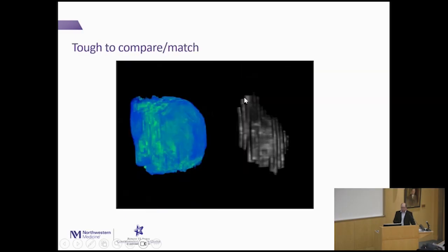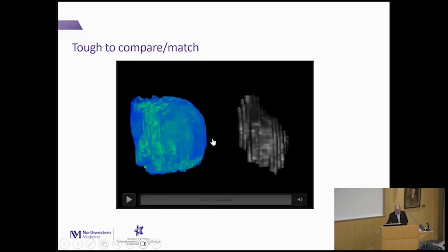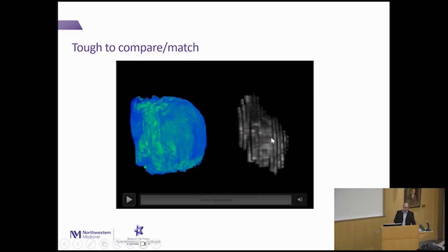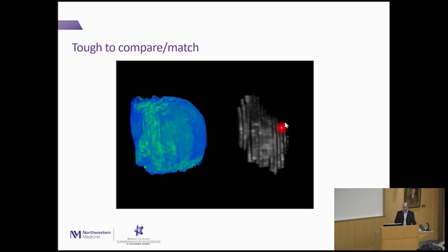And that's where you have to, I don't think this one has the codec. It's fine. This is a 3D rendering of the ex vivo and in vivo. The in vivo, this shape here, you can see the endorectal coil is not only pushing it to curve it, but it's also pushing it to make it go down. And then on the ex vivo, it's flat and it's expanded. It's also a higher resolution. So this kind of stair-step appearance is because the in vivo is lower resolution. So this is 1.5 Tesla and this is 9.4 Tesla.